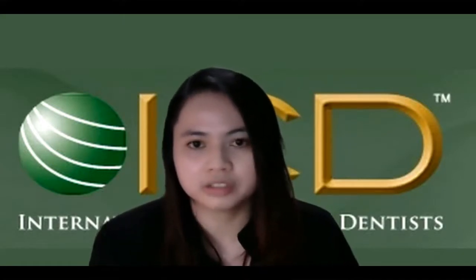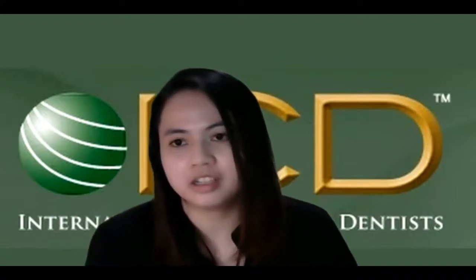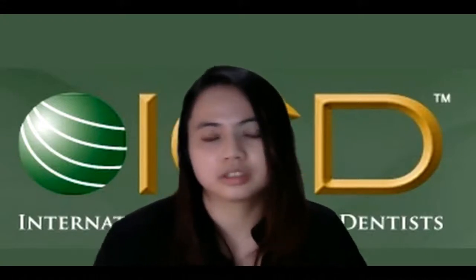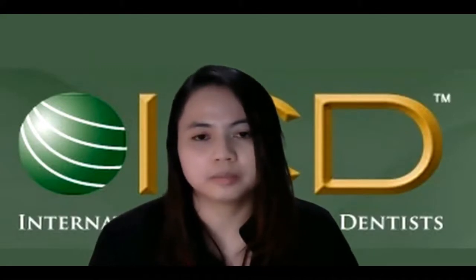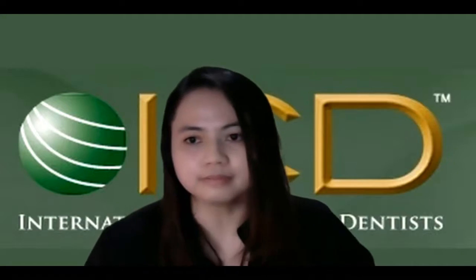Also for conservative dentistry, maybe onlay, inlay, and there are many kinds of uses. Also implant dentistry can use it for digital implant planning or virtual treatment planning. It's also using CAD/CAM and 3D printing.